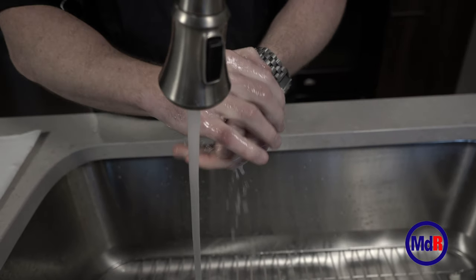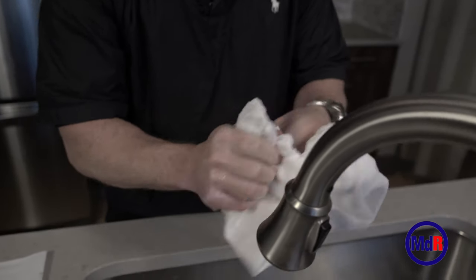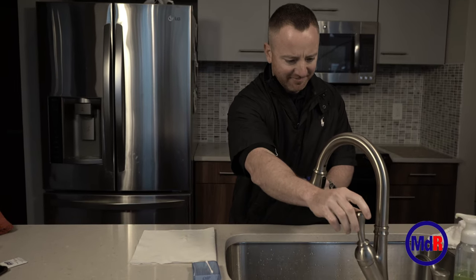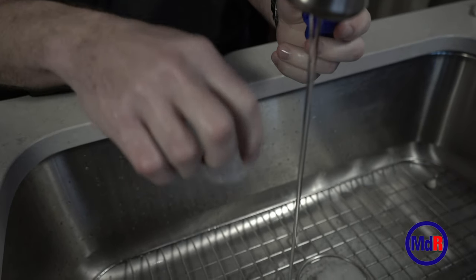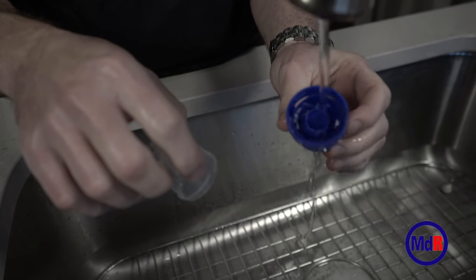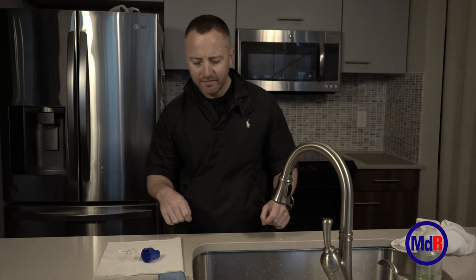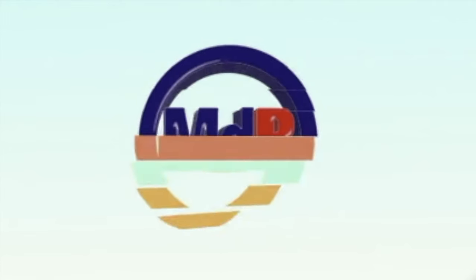After you're done with your treatments, make sure you wash your hands before you clean the circuit. Clean the circuit at least once a day when you're done with your treatment. Rinse the medicine cup with water, then set it on either a hand towel or paper towel and let it air dry. That should do it — thank you very much, have a blessed day.